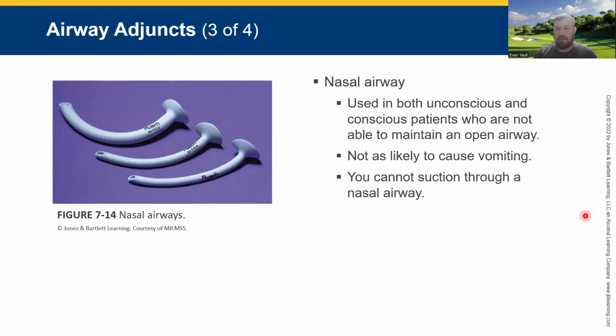The contraindication, the time when you cannot use this, is if you have facial or head trauma. You cannot use these. That's super important to know and understand. If there's facial or head trauma, we are not putting these in the nasal cavity. You can use these in both unconscious and conscious patients who are unable to maintain an open airway. They're not as likely to cause vomiting, because we're not touching that little dangly thing in the back of your throat.